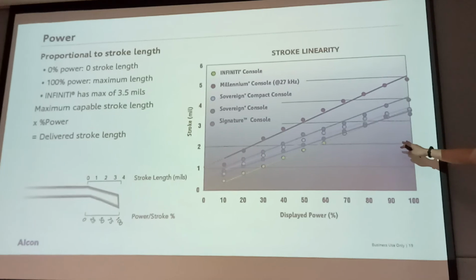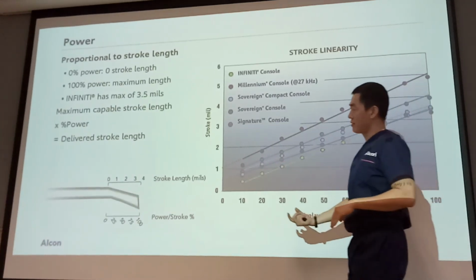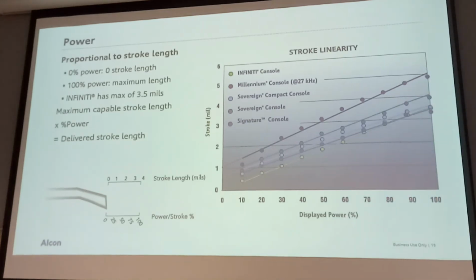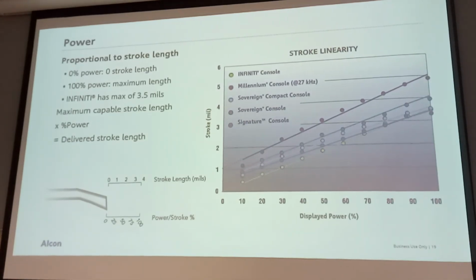And different companies are using different stroke lengths. On the screen, we see 30, 70, 100. There's a unit on the back. It's a percentage. Percentage of what?